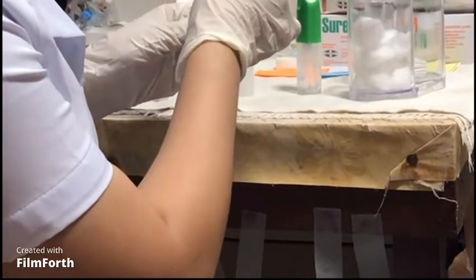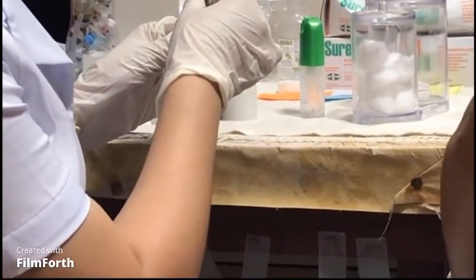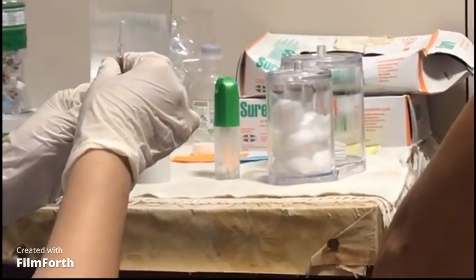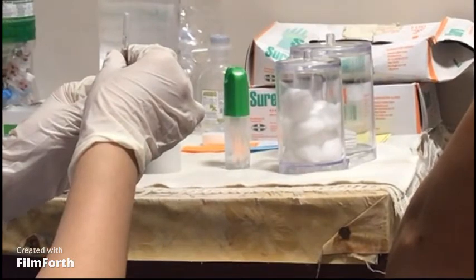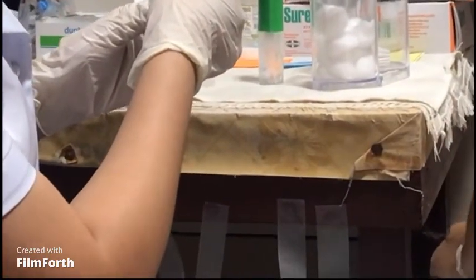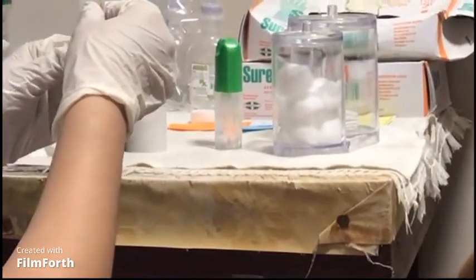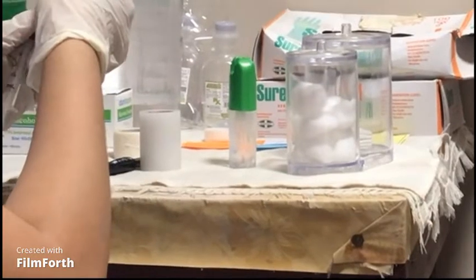Remove the needle cover without contaminating the needle. If using a pre-filled unit dose medication, take caution to avoid dripping medication on the needle prior to injection. If this does occur, blot the medication off the needle with sterile gauze, then inject the medication using a Z-track technique.